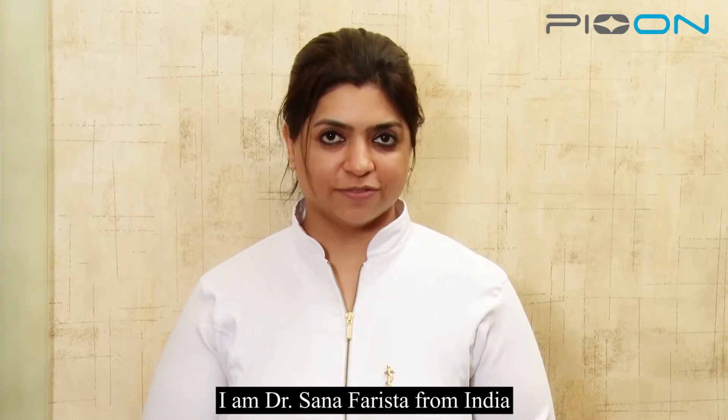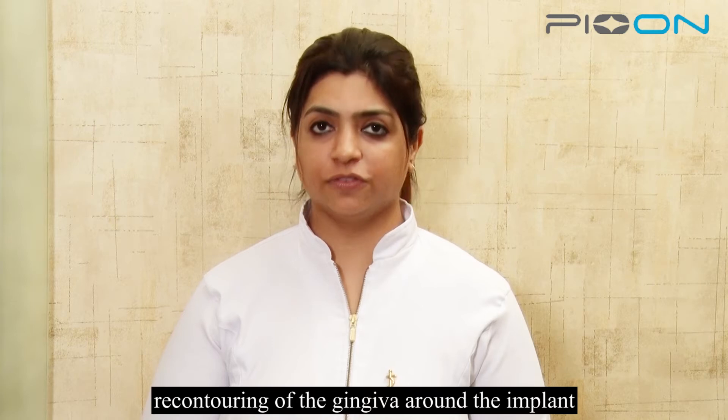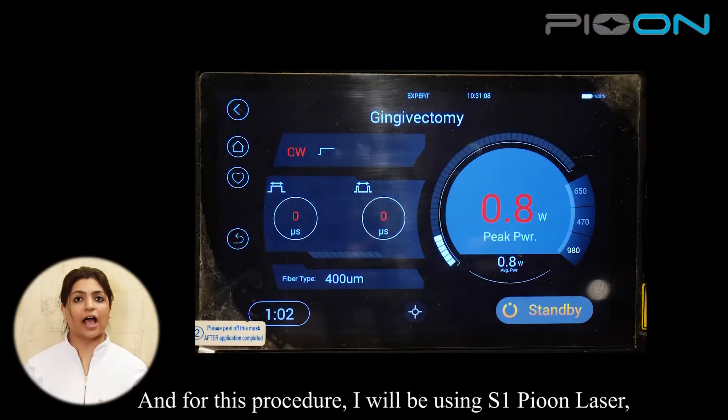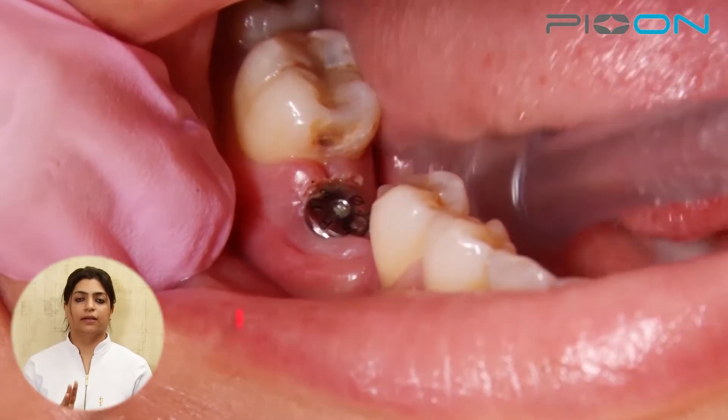Namaste everyone, I'm Dr. Sana Farishta from India. Today we are going to talk about recontouring of the gingiva around the implant. For this procedure I'll be using the S1 Pioon laser at 980nm wavelength, at 0.8 watts continuous mode.